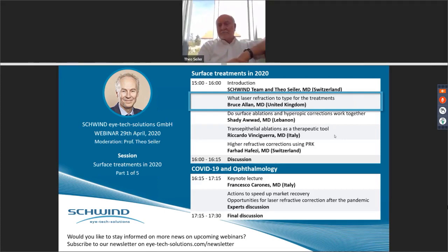I think that once you are getting to stage 3 and 4, then you are looking at doing rings, for example, first, or even a corneal transplant. I think a very important point to make is that trans-PRK and cross-linking, the kind of combined treatments, these work for the patients with early stage keratoconus. But once you are with vision worse than, say, the driving standard and stage 3, stage 4 cones, you really need to do a gross correction of shape first. And again, if people have the energy to look at YouTube, I've got a video on the approach to treating irregular astigmatism there that makes all of that clear.